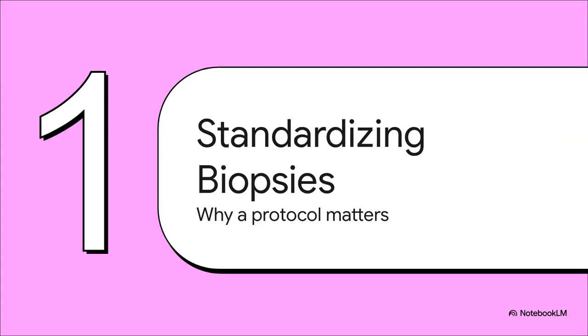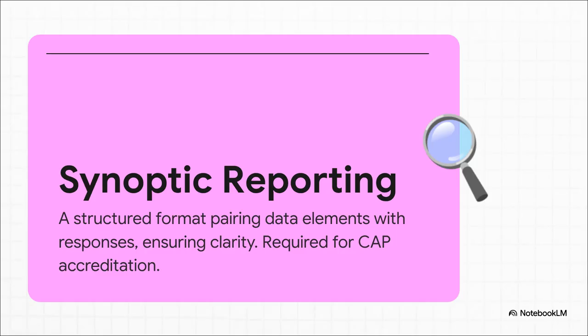This entire system is really built on one core idea, the requirement for synoptic reporting. But what in the world is synoptic reporting, and why is it so incredibly important? So this is not just about making your reports look neat and tidy. It's a critical patient safety tool.